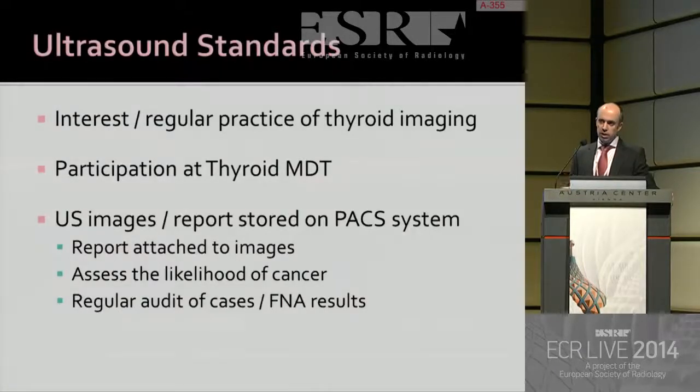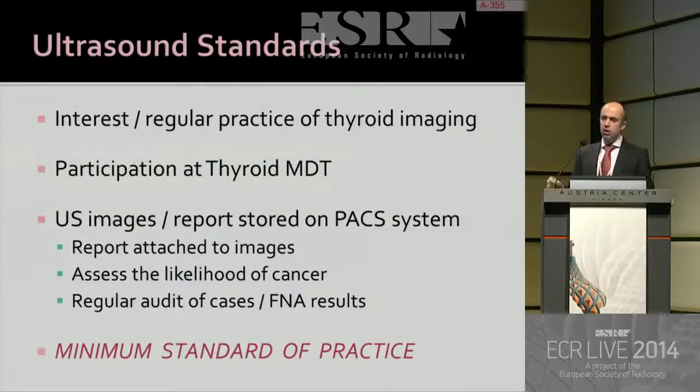So just to reiterate, anyone in your hospital outside of the radiology department starting to perform neck ultrasound or thyroid ultrasound, they should be taking formal images stored on a PACS system with an associated report. This is the only way we can allow effective audit and governance and follow-up and assessment of our effectiveness. And this should be the minimum standard of practice for anyone doing thyroid ultrasound.